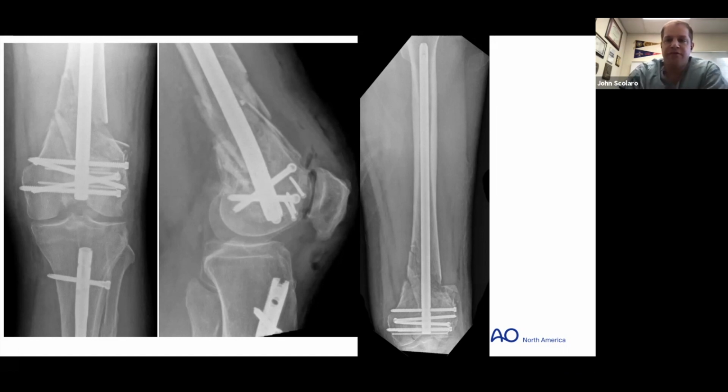There's a question about flexion extension of the articular block, and Drew, I would just say that the most important thing here is making sure that your start point and your initial trajectory with your guide wire is spot on. We'll take a tremendous amount of time making sure that the entry portal and the path in the distal segment is righteous, because these can very easily go into extension as well. Less commonly they go into significant flexion, but oftentimes extension. You want to make sure you have those condyles tucked down at about 90 degrees.